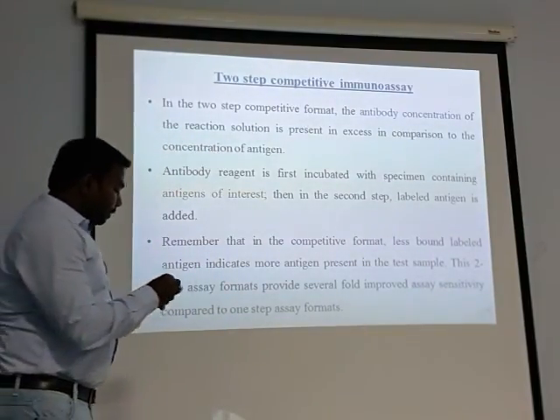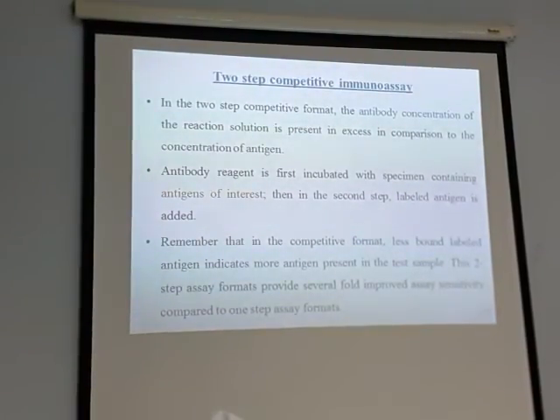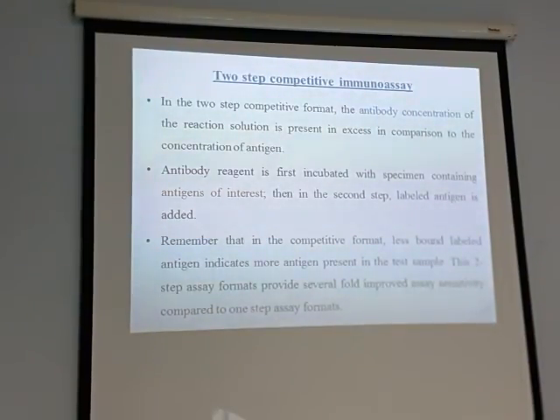In the two-step competitive immunoassay, the antibody concentration in the reaction solution will be more. If the labeled antigen binds, there is no space for the unlabeled antigen, so it is negative. So in two-step competitive assay, the antibodies will be in excess, more amount of antibodies.